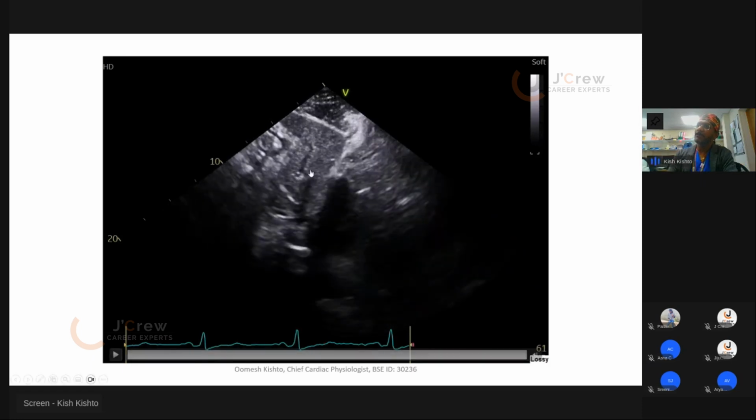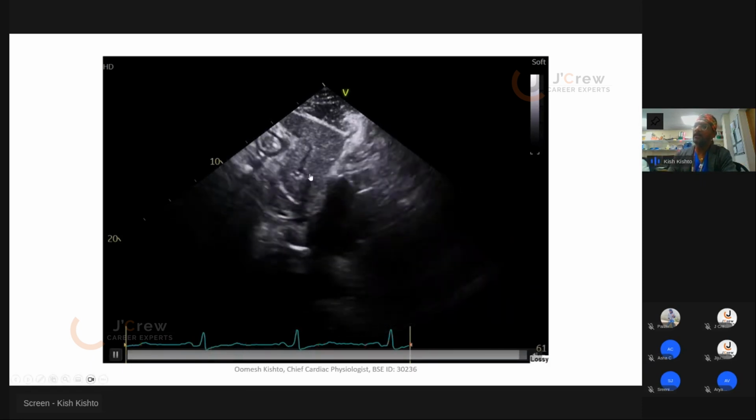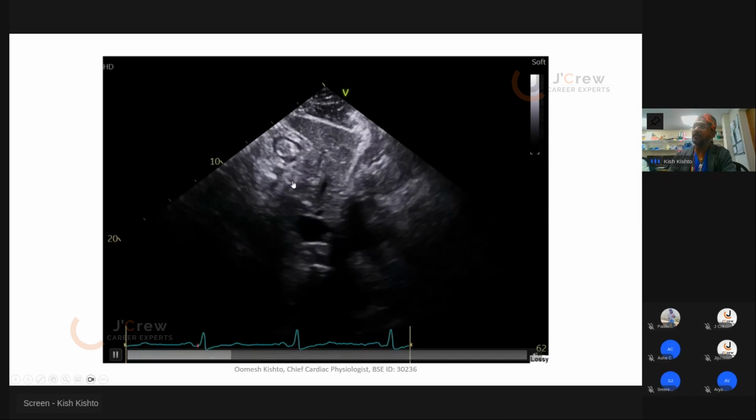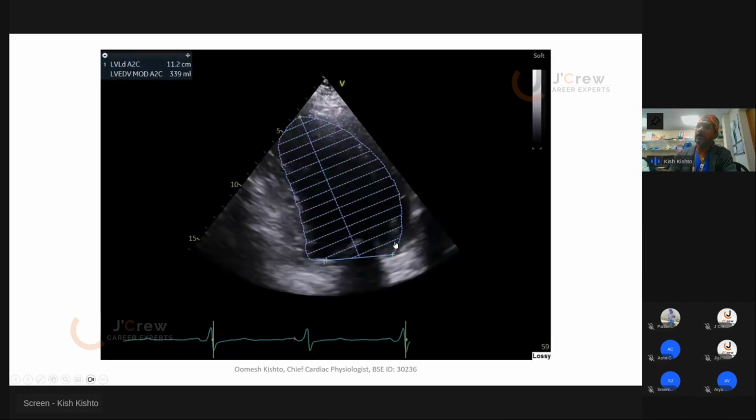Look, sometimes there's an accidental finding in the liver there. I can't remember if I mentioned that in my report. We are not trained to comment on the liver. We'll look at the report next.